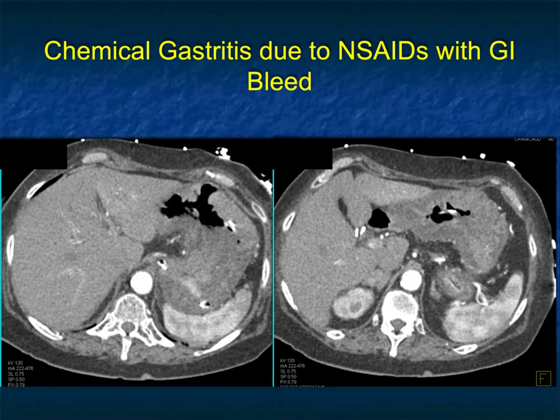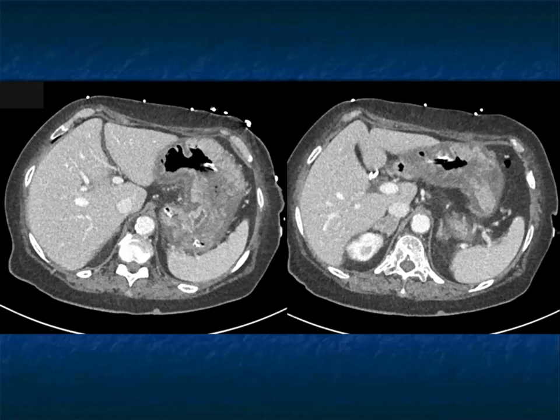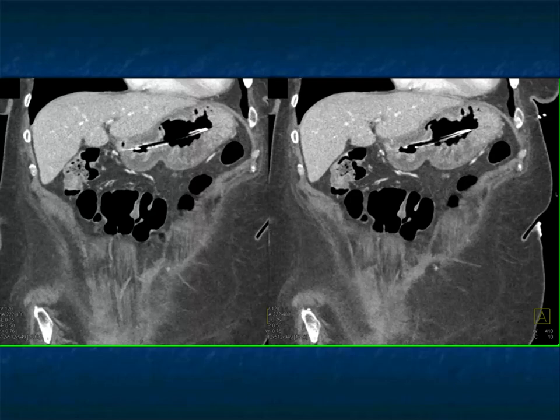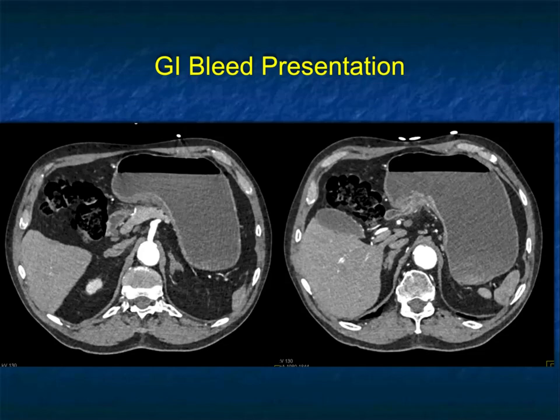Another example: a patient taking NSAIDs presents with GI bleeding. The stomach wall is thick and there is high-density material in the fundus. On arterial-phase imaging, you could consider whether the patient was on Maalox or ingested something else. But going from arterial to venous phase, the area of active extravasation and blood increases, making you much more comfortable this is a true bleed. Ingested material would stay the same between phases; here it changes in extent, density, and distribution. Very classic diffuse gastric thickening with GI bleeding confirmed.